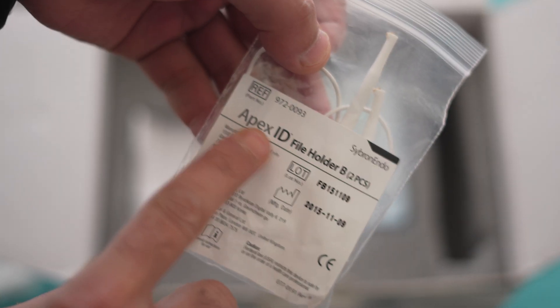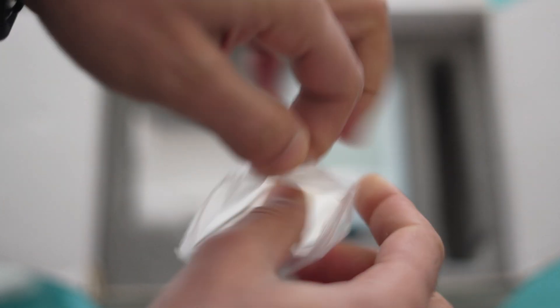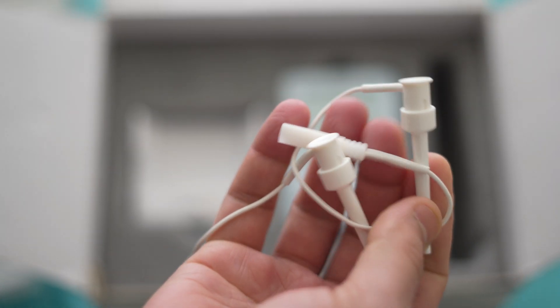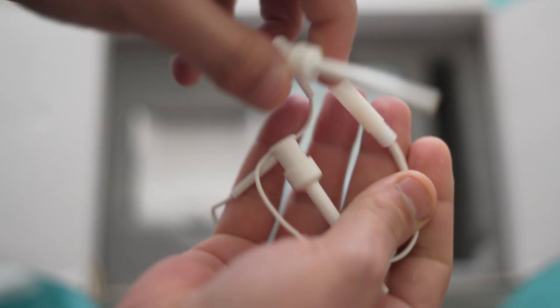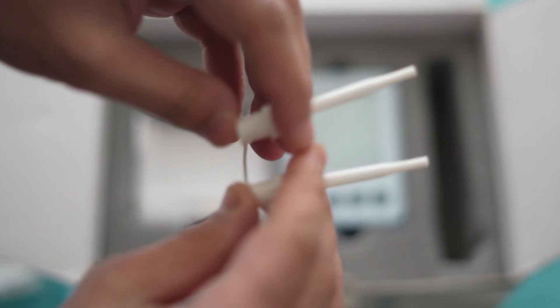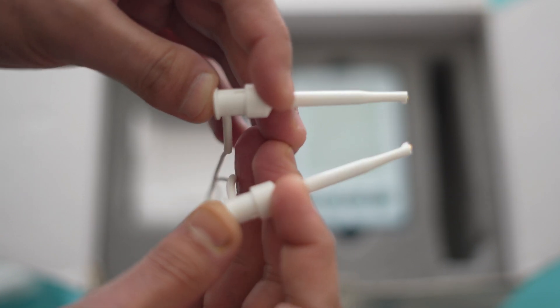The next one is this Apex ID file holder B — they are two in number. These two file holders are for holding the file during the procedure. Here I will show you the two small clips inside this type of file holder, which actually holds the file during the procedure. You can see these clips very well.